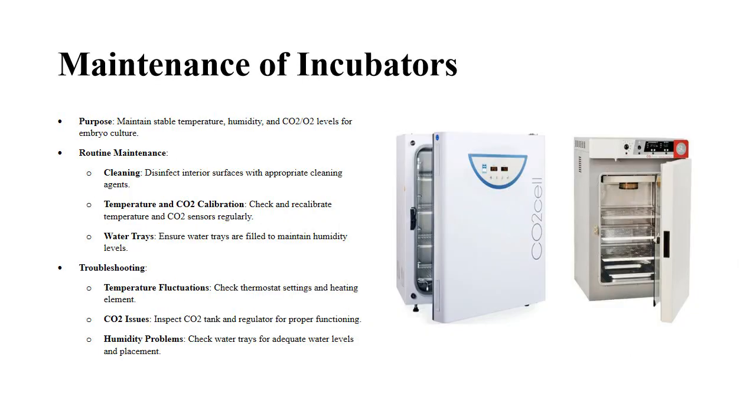B. Incubators. Purpose: incubators provide a stable, controlled environment for embryos by maintaining proper temperature, humidity, and gas levels, CO2 and O2. Routine maintenance, cleaning: wipe down the incubator's interior with disinfectant regularly to avoid contamination. Use non-toxic agents to clean surfaces that come in direct contact with embryos.